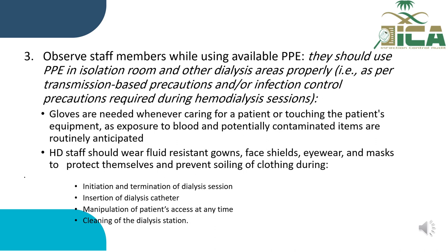Gloves are needed whenever caring for patients or touching the patient's equipment, as exposure to blood and potentially contaminated items are routinely anticipated. Hemodialysis staff should wear fluid-resistant gowns, face shield, eyewear, and mask to protect themselves and prevent soiling of clothing during initiation and termination of the dialysis sessions, insertion of dialysis catheter, manipulation of patient's access at any time, and cleaning of the dialysis station.